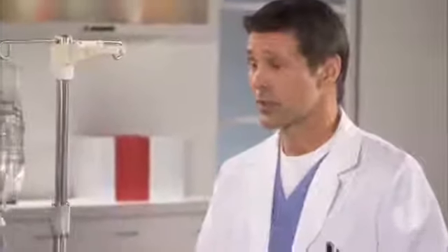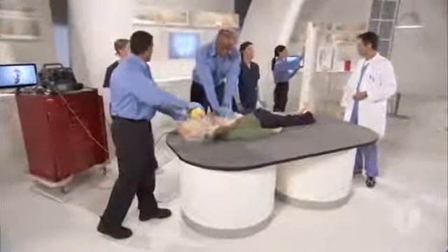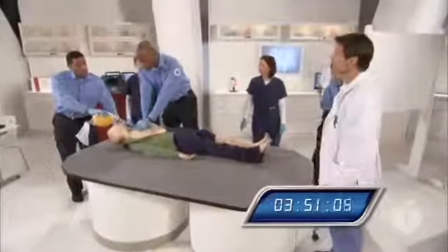Great. We've given 2 shocks and given 1 milligram of epinephrine. The next medication to consider is amiodarone. Dana, please prepare 300 milligrams of amiodarone. Drawing 300 milligrams of amiodarone. Sam, are you getting good chest rise? Yes, and I'm being careful not to deliver ventilations too quickly or forcefully. Okay, great. Let's continue there.